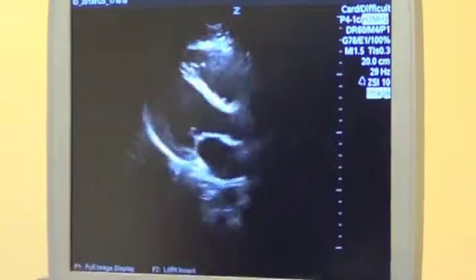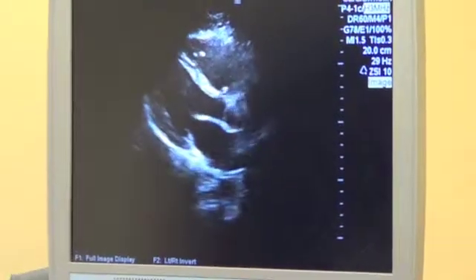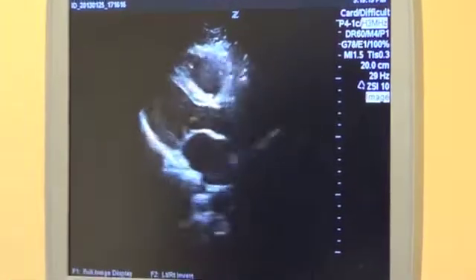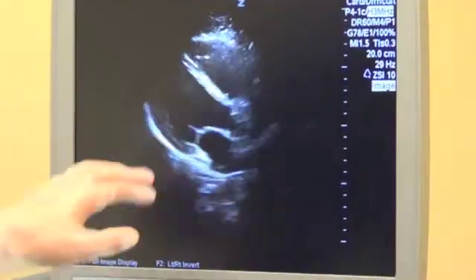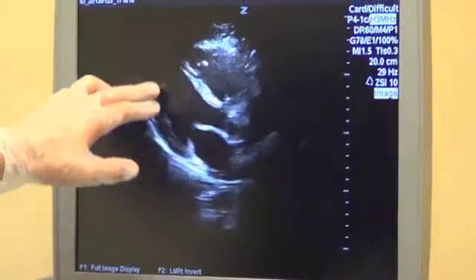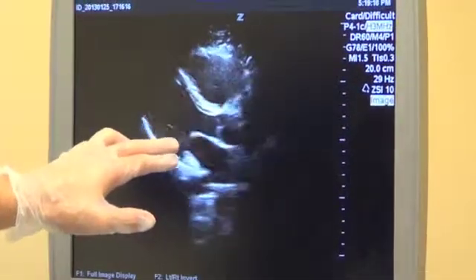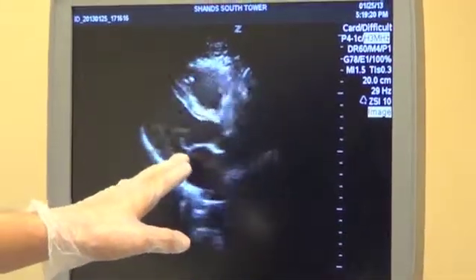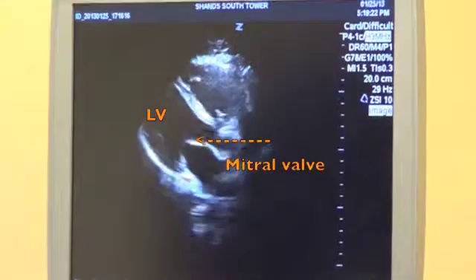Now we have an optimal left ventricular long axis view. We know this because the left ventricular cavity is well visualized, including both the mitral and the aortic valve.